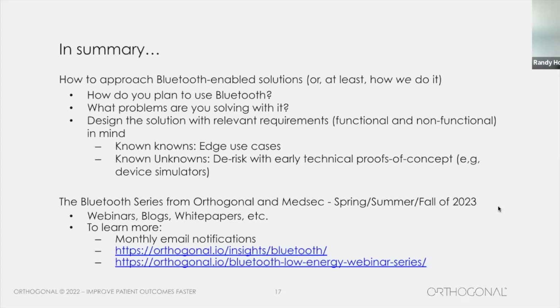And then there's sort of known unknowns, which are things that you want to de-risk with early technical proofs of concepts, things such as a device simulator, which we can talk about.